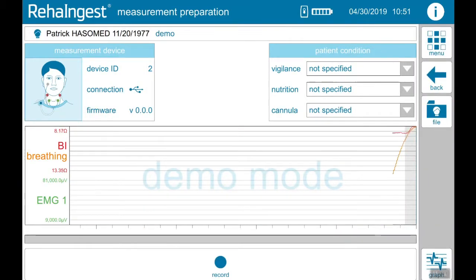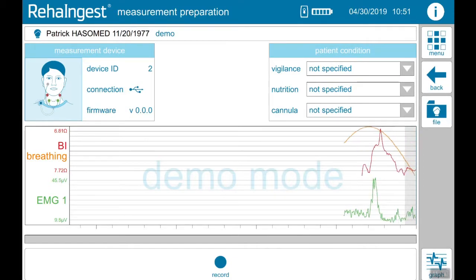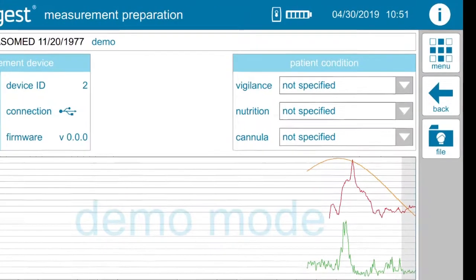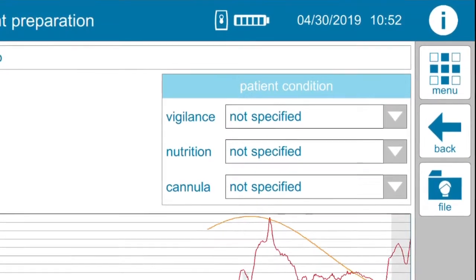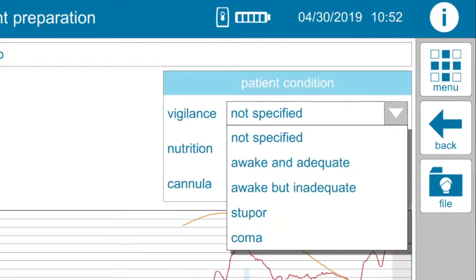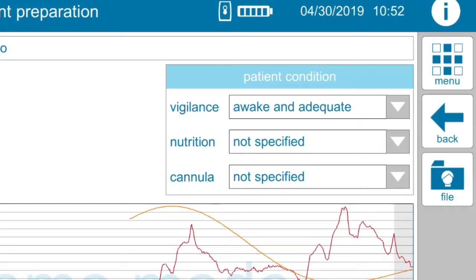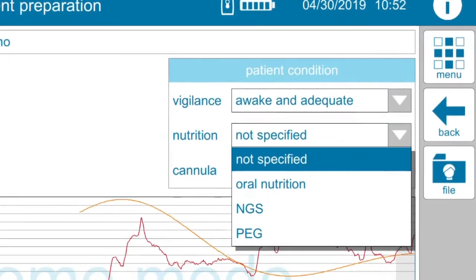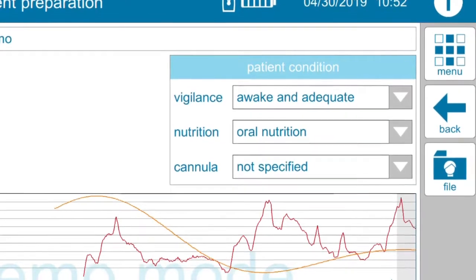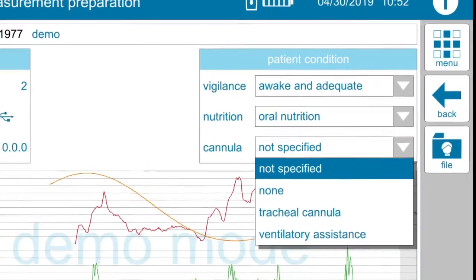This will bring you to measurement preparation. On the top right you can specify vigilance, nutrition and cannula status.